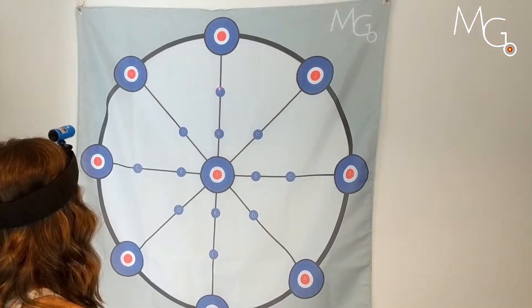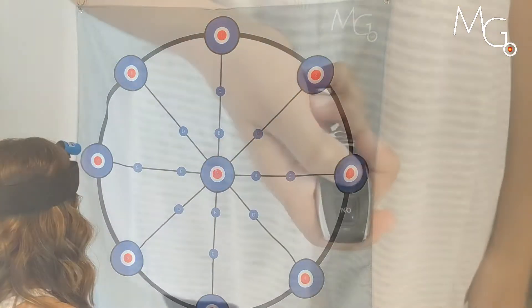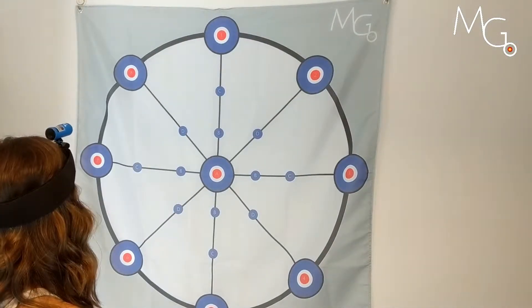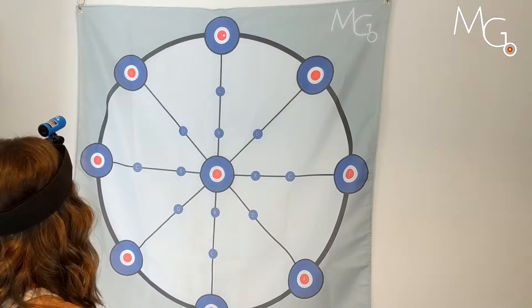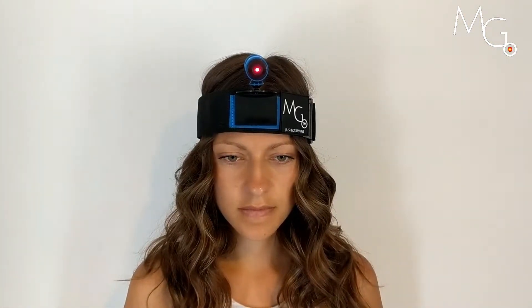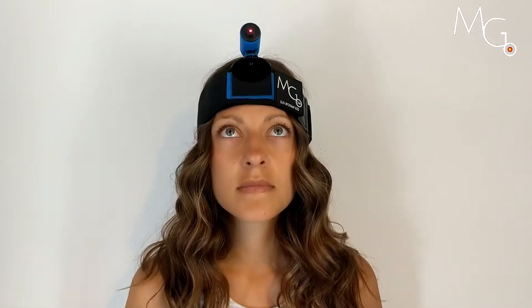This video demonstrates using the Motion Guidance Remote Activated Laser Pointer. We created this device to allow the clinician to add or subtract visual cues during exercise, or allow the client themselves to remove visual feedback when desired.